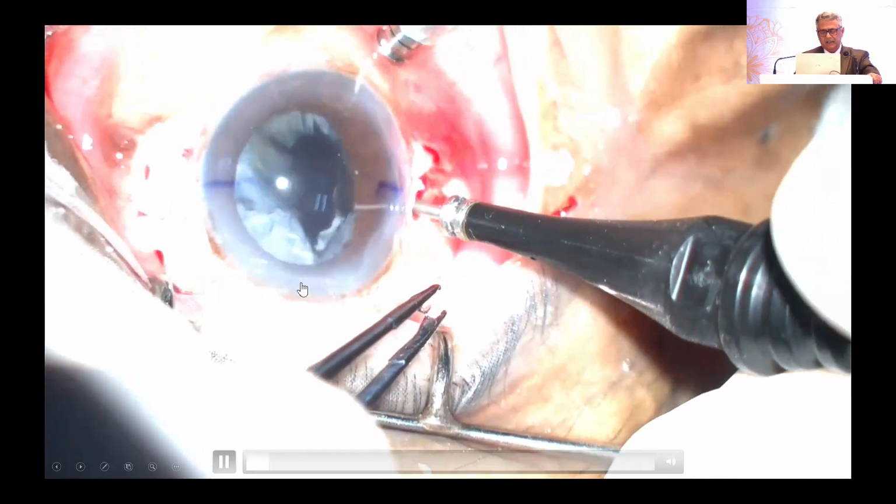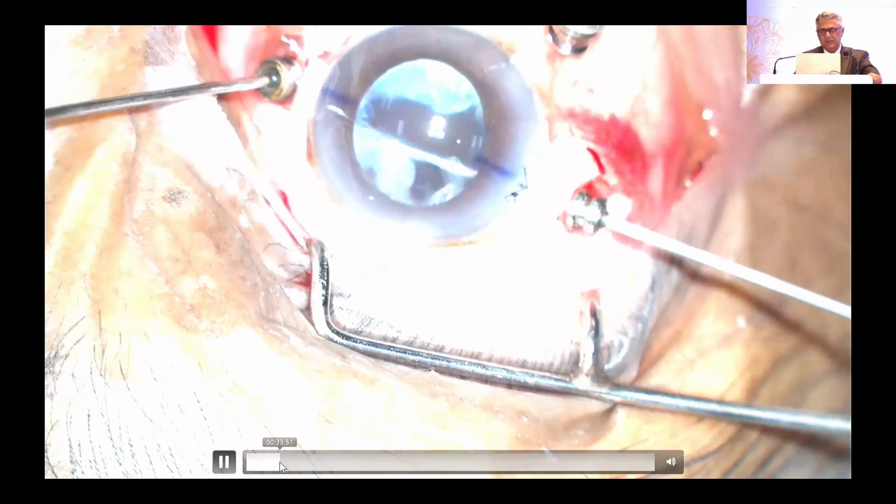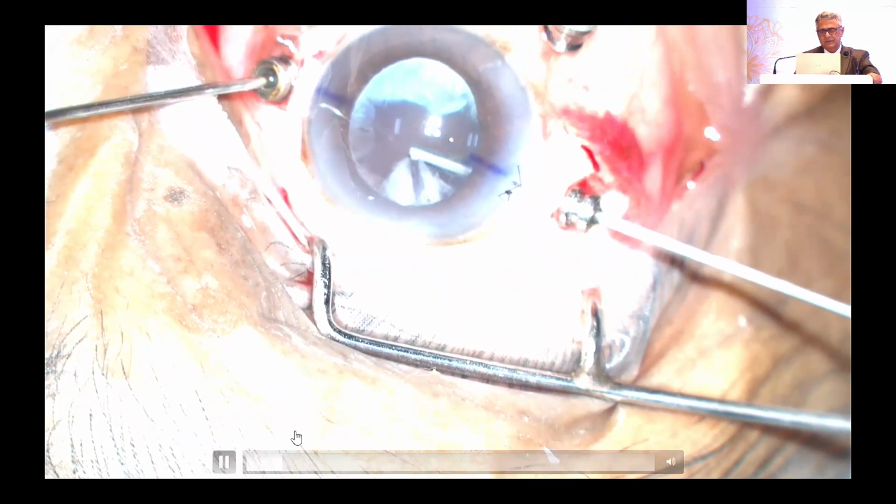So we had this vitrectomy to be done first and remove this matter from the anterior segment so that the visibility in the posterior segment improves. There is cortical matter, there is a nucleus piece there. So the aim is not to remove this white matter first; the aim is to sever these connections between the lenticular matter and the vitreous. Do a vitrectomy as good as you can. The aim is to remove the traction on the base.